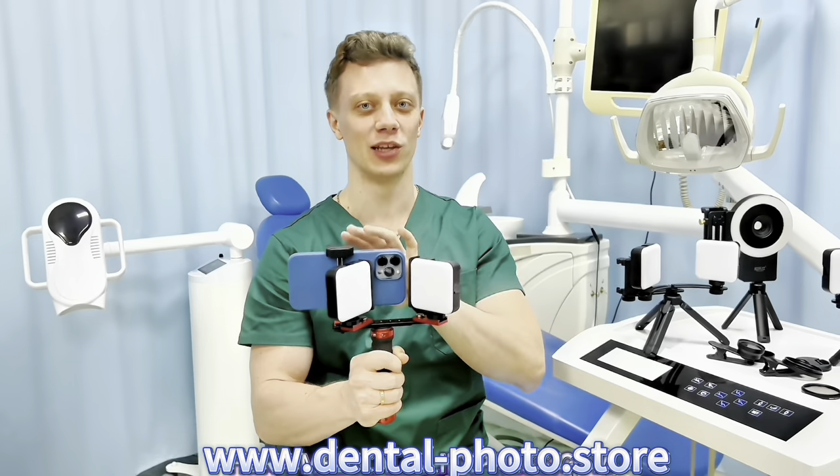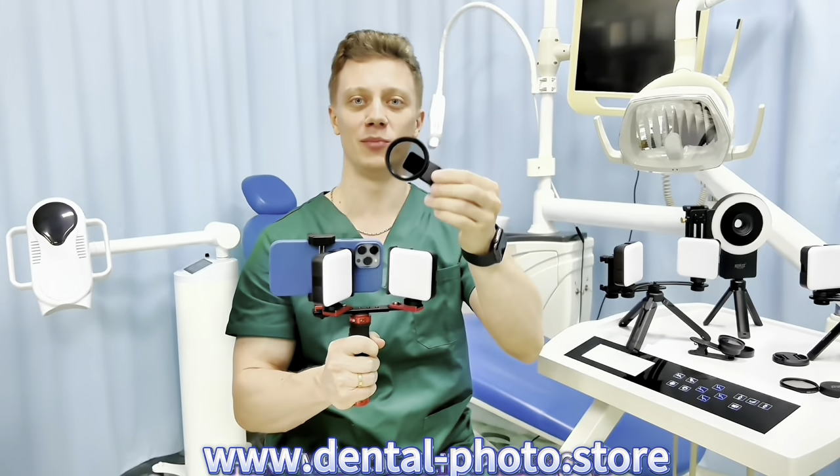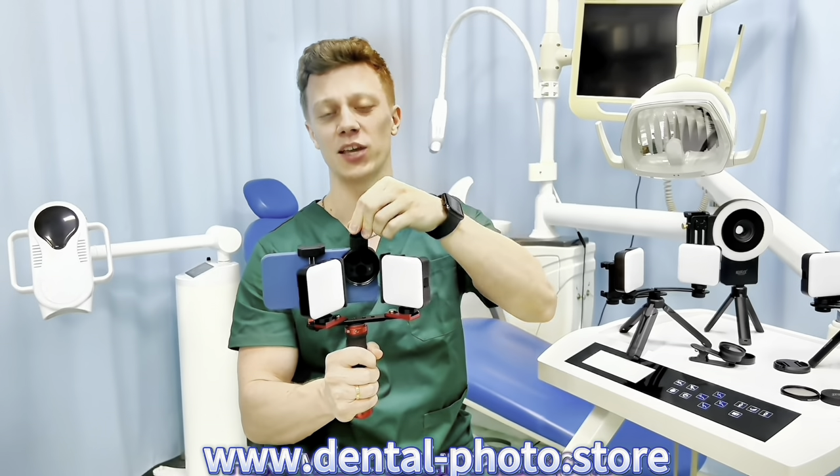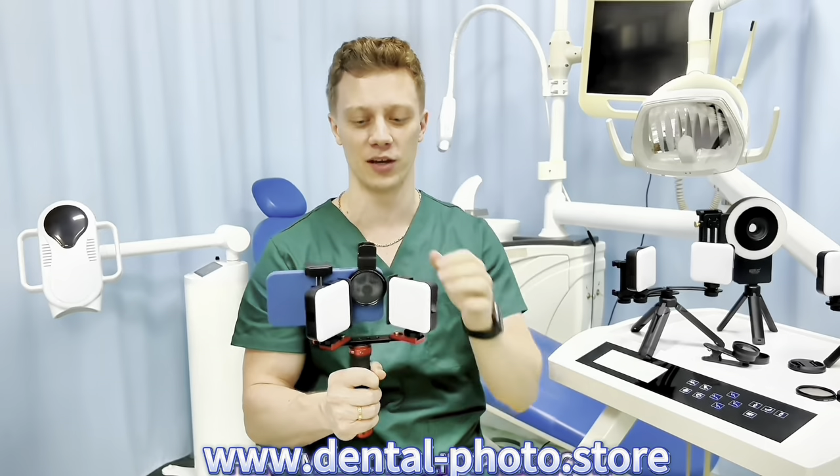It also has the foam clip. The maximum width is 11 centimeters, so basically you can use any phone with the MK16. You can order MK16 alone or you can get it with accessories like this 52 millimeter CPL filter. It can help you minimize the reflections on skin if you do full face photography.